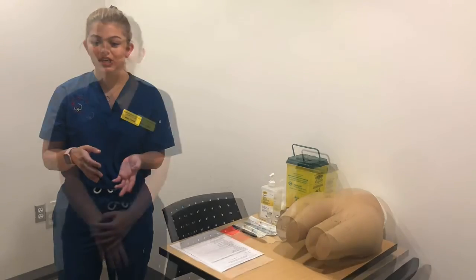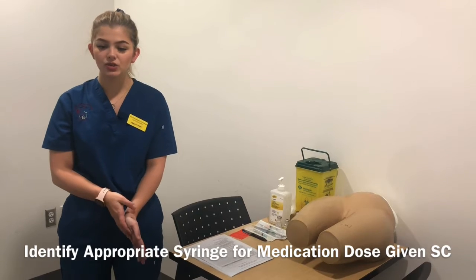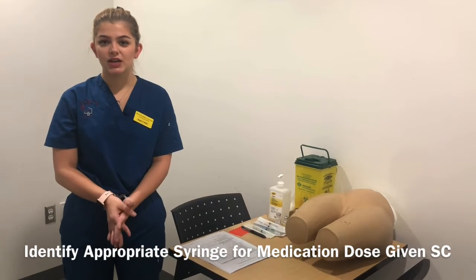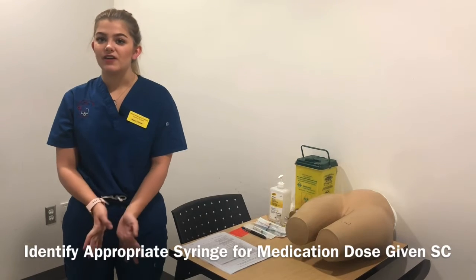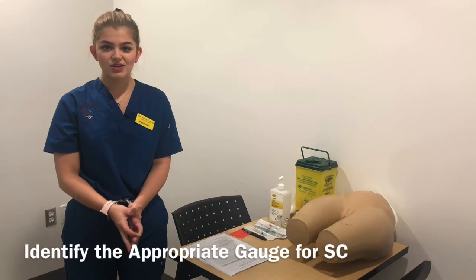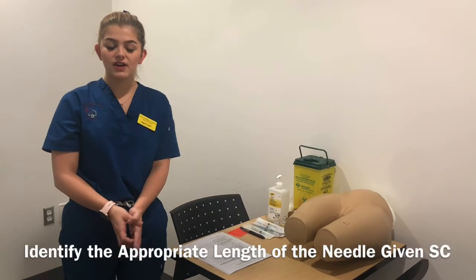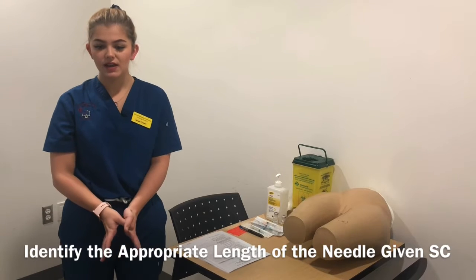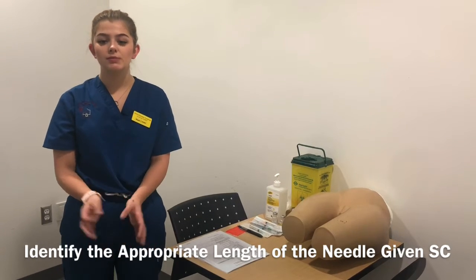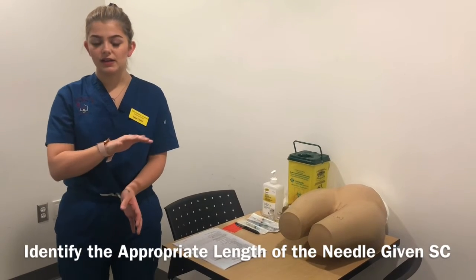For subcutaneous injections, I'll be using a 1 to 3 milliliter syringe. So I want to choose a 1 milliliter syringe just because it's the most accurate syringe to measure the 5,000 units of heparin. The appropriate gauges are 25 to 27. The appropriate length of the needle varies from 3/8 to 5/8. And the needle is shorter for subcutaneous injections because you want to penetrate the adipose tissue layer. It's like the fat layer underneath the skin.